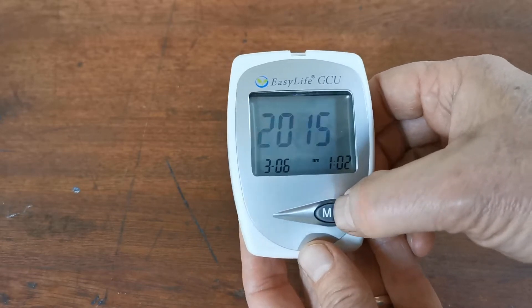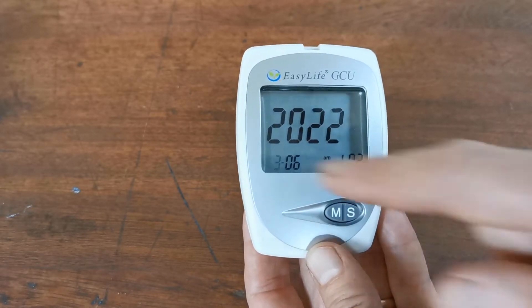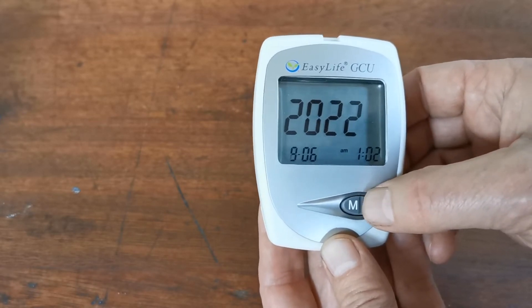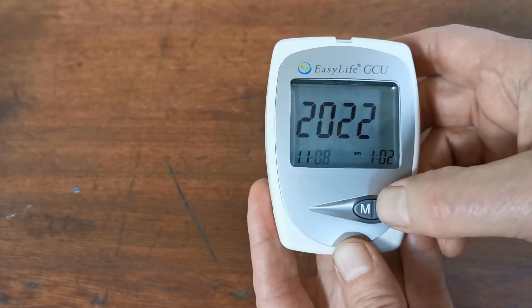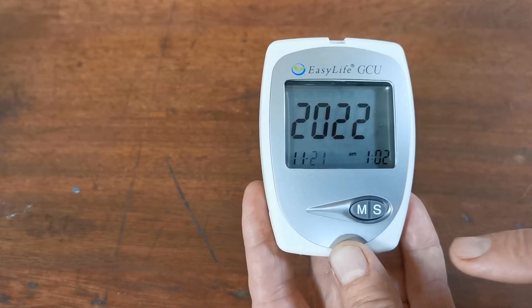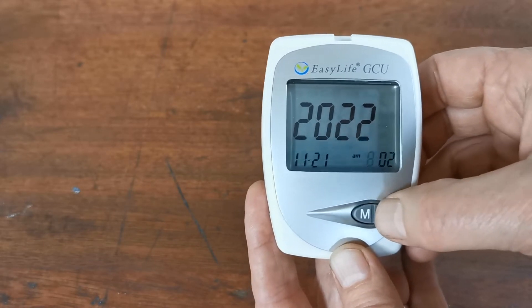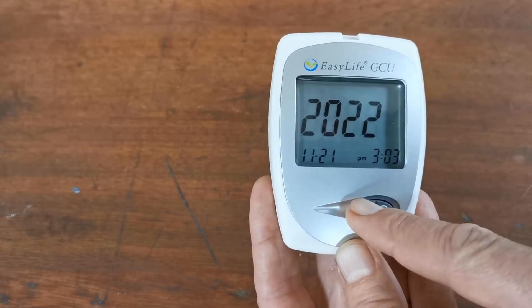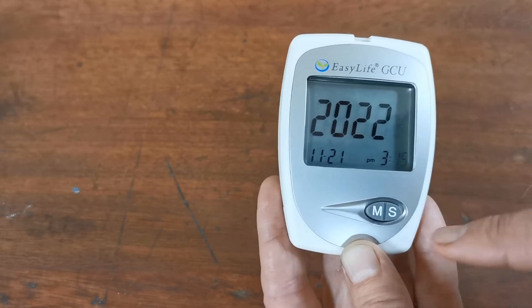To change the year, hit the S button to cycle through — 2017, 18, 19, 20, 21, 22 — and when you've got the correct setting press the M button. The next flashing indicator is for the month. We're going to set that for November, so we'll go to 11 and press the M button again. The day is then flashing — we're going to set it to the 21st of November. When you're happy with the date, hit the M button. The next flashing indicator is the hour; go up to the correct time. It jumps from a.m. to p.m., so we're going to set 3 p.m. Then set the minutes to 3:15 and hit the M button.